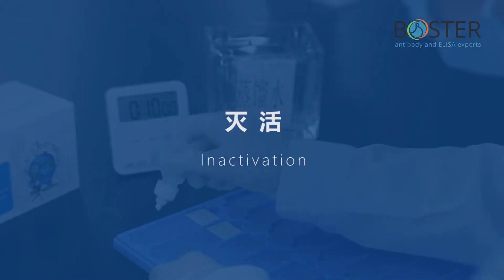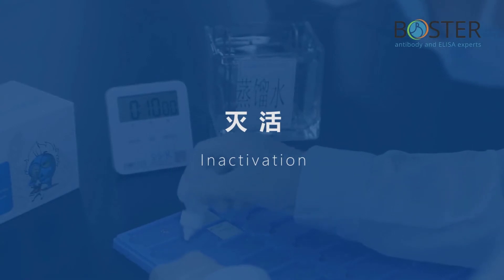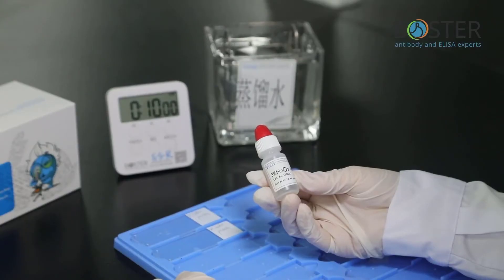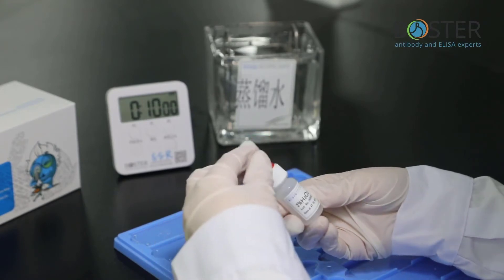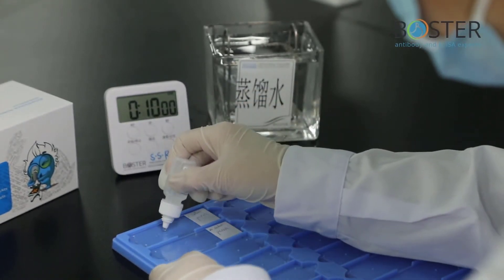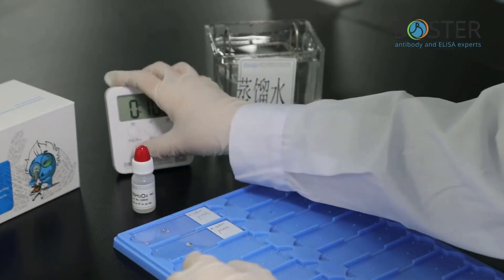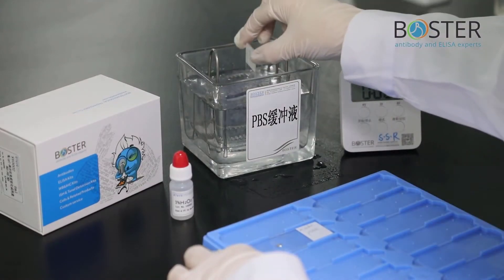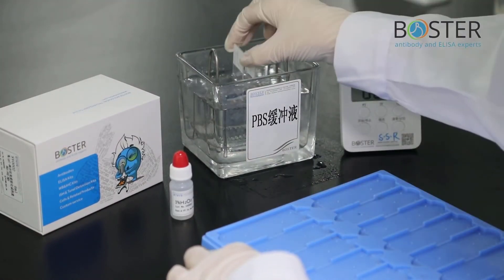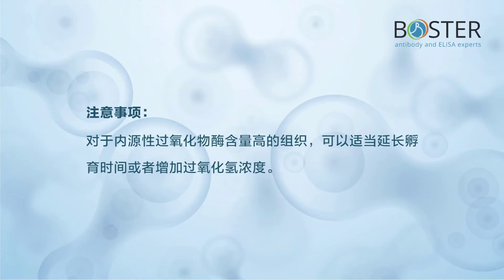Step 3: Inactivation. The purpose is to inactivate endogenous peroxidase and to reduce the interference of endogenous peroxidase on the chromogenic system. This is the endogenous peroxidase blocking solution used in the inactivation process. Add one drop of endogenous peroxidase blocking solution. Incubate at room temperature for 10 minutes. Wash with PBS buffer three times, five minutes each time. Precautions: for tissues with high endogenous peroxidase content, the incubation time should be appropriately extended, or the concentration of hydrogen peroxide should be increased.